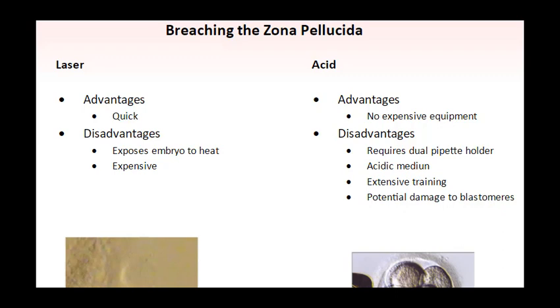The laser is quick and easy to operate once properly trained. However, the laser pulse heats the culture medium in zona pellucida, which may potentially damage the embryo. The laser is an expensive piece of equipment for laboratories to purchase and usually is linked to a Windows-based computer system. For laboratories working with a biopsy specialist who comes in just to perform biopsy cases, the specialist may bring a laser, but it may or may not adapt to the inverted microscope in the laboratory.